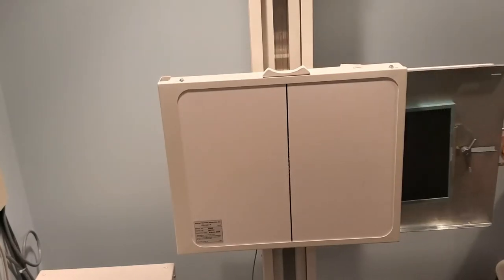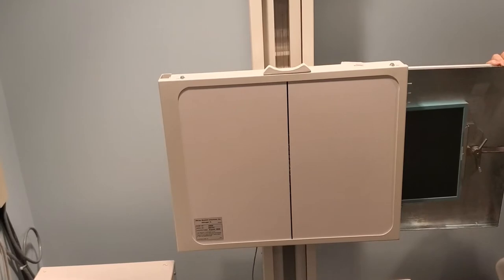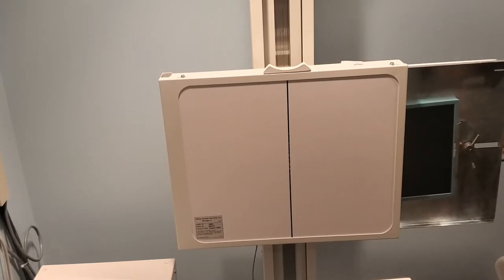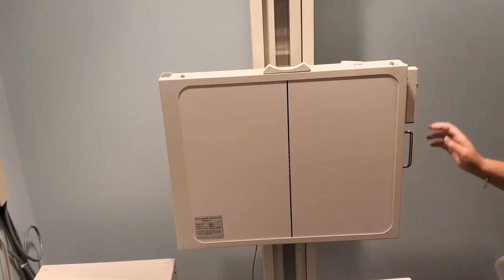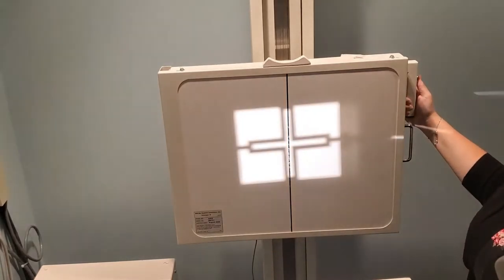The first two projections we're going to do for the shoulder is the AP projection of the shoulder. This has three different variants that you could pull for your proficiency: either external rotation, internal rotation, or neutral hand position. You should be using a 10 by 12 inch cassette crosswise in the upright bucky, and just make sure that you have your tube and your bucky aligned.